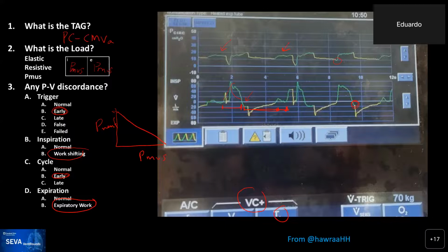So yes, and then well, you bring a great question here, about sedation, and she says, well, the patient was not sedated anymore, and it may be. We have seen these transitions from early trigger that occur as you stop the sedation, they may come and have more of that, but as they start waking up, this goes away. So there's, in our experience, some relationship, although there's no book on that.